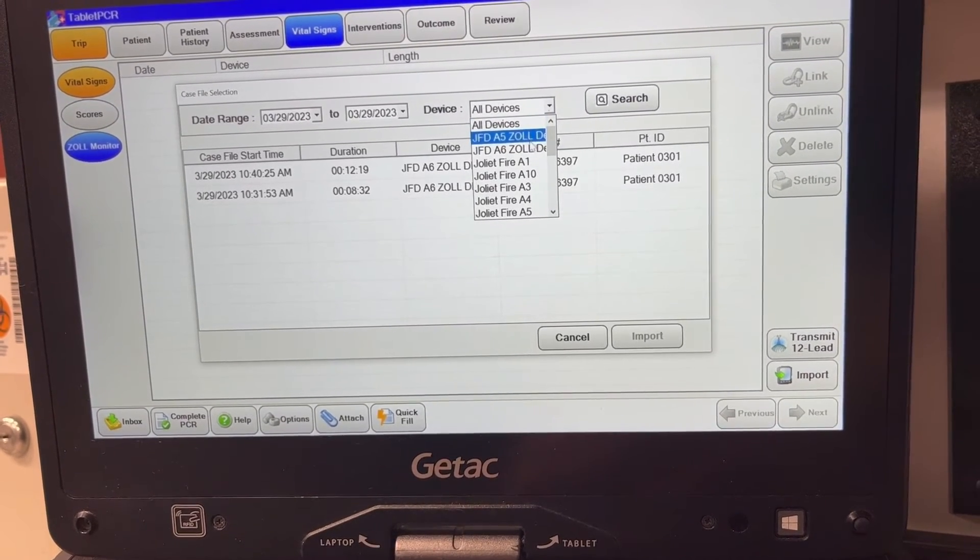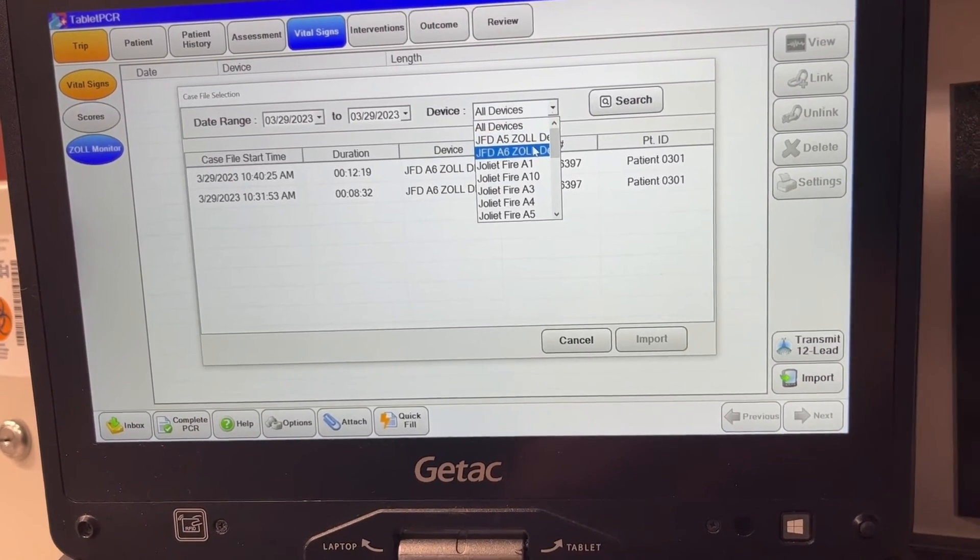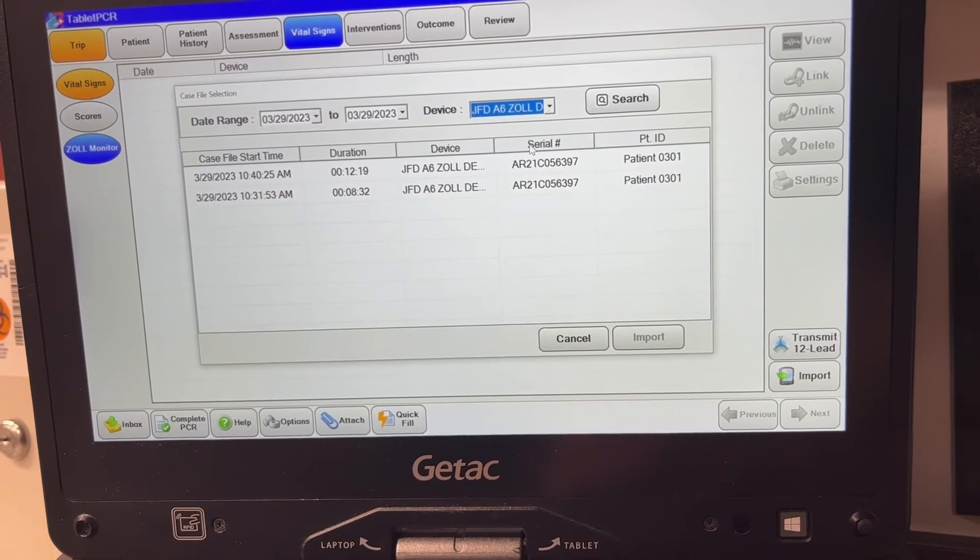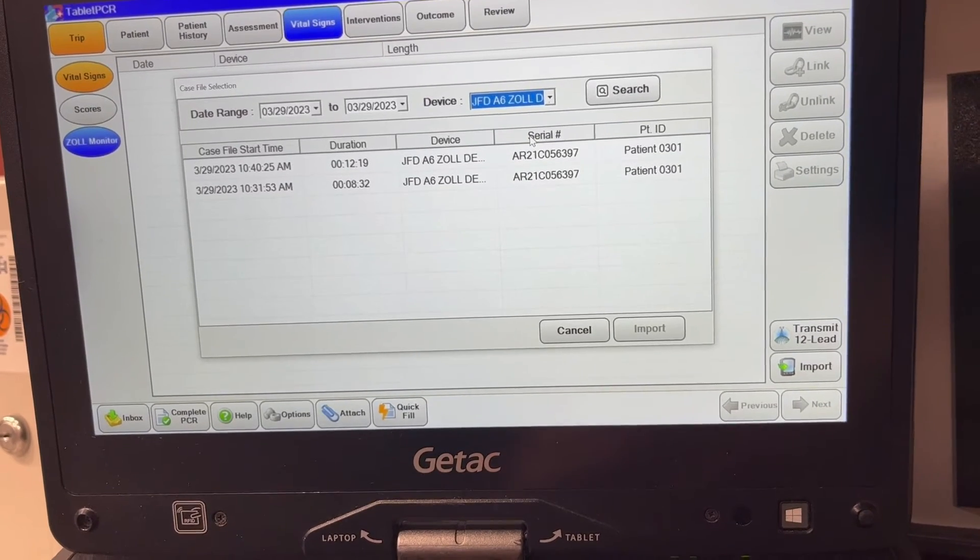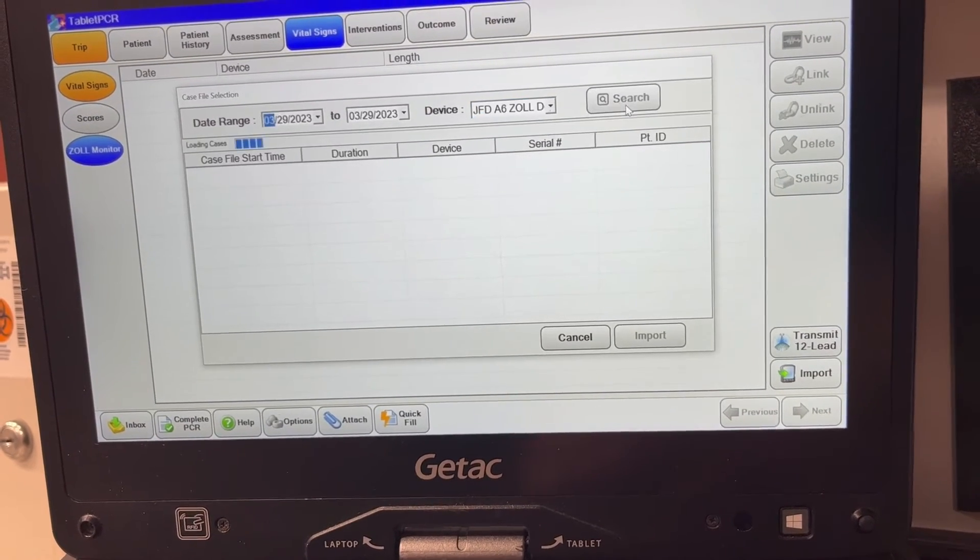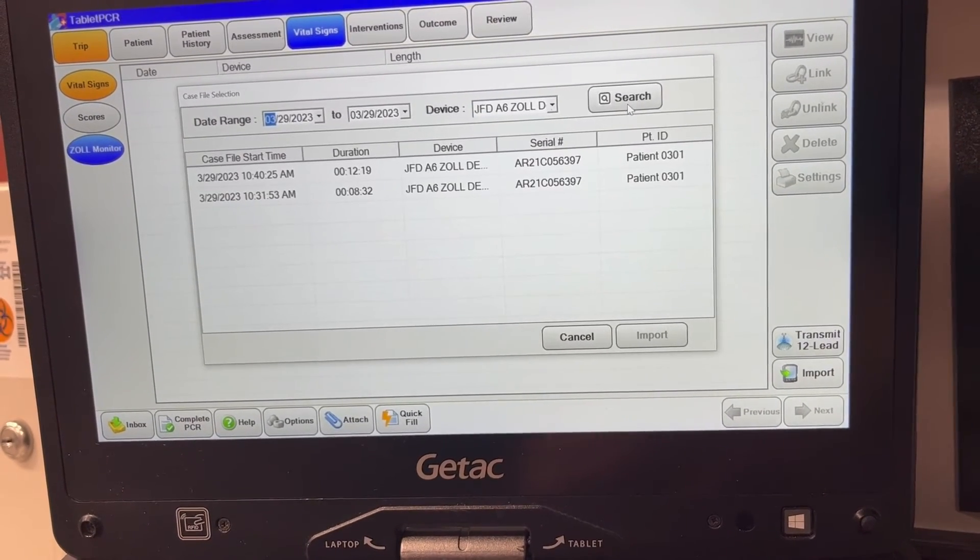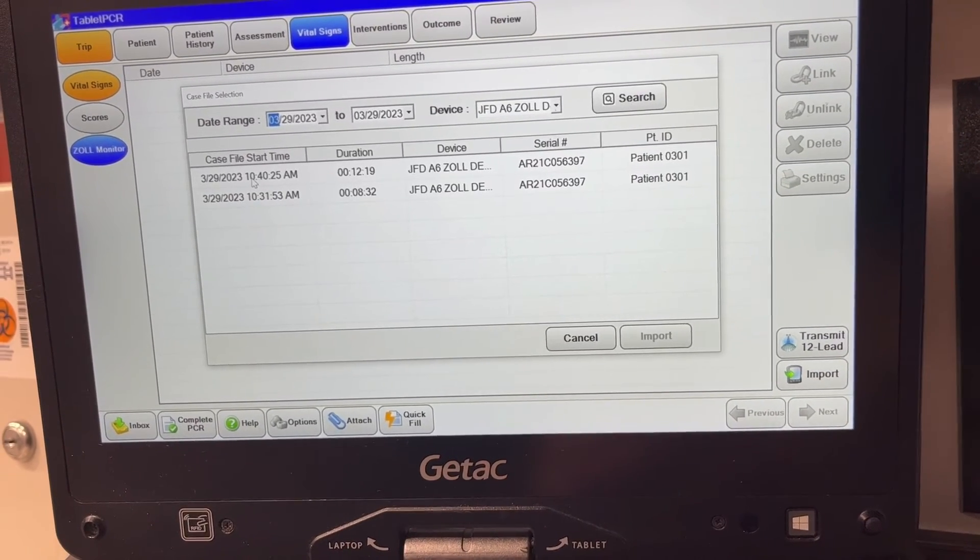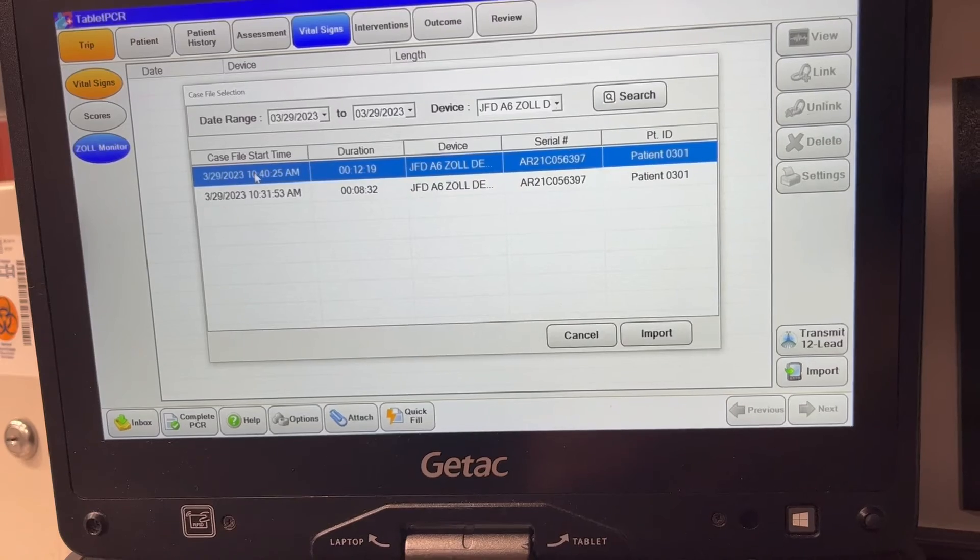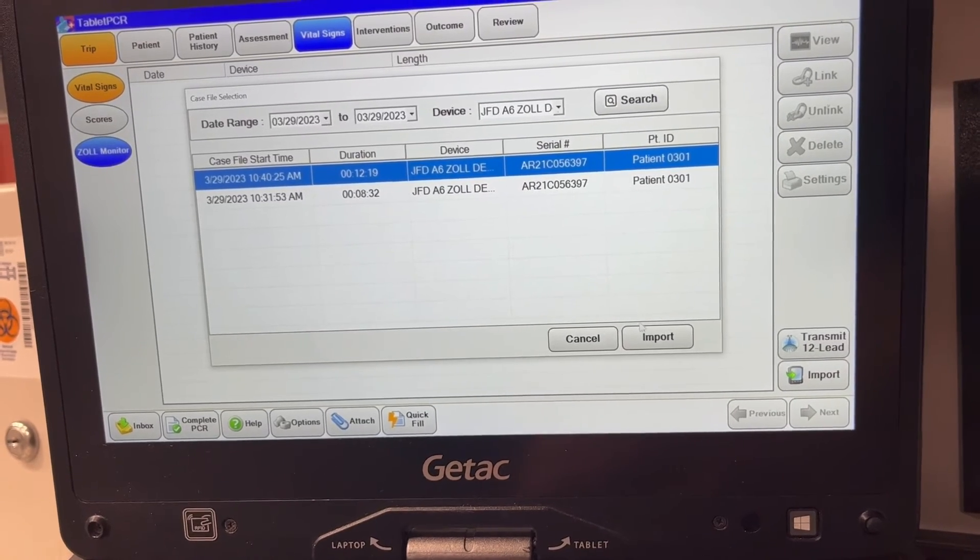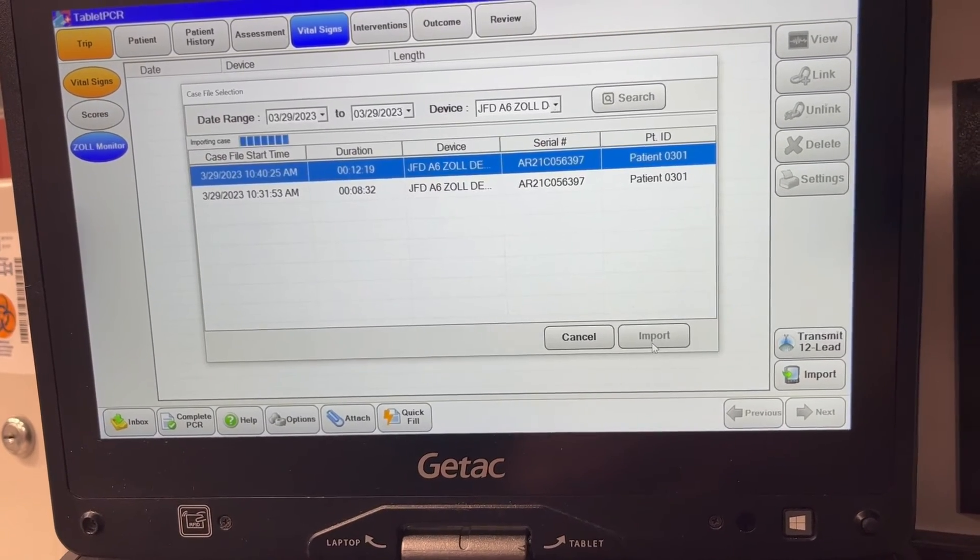So for example, I'm going to pull from JFD A6 Zoll demo. We can do a search and it'll narrow down to just those case files. I can click on the one I want, hit import.